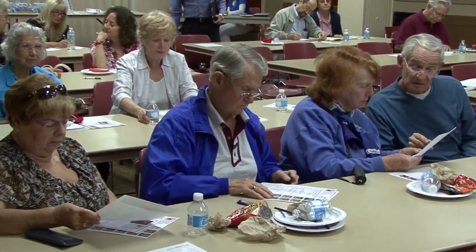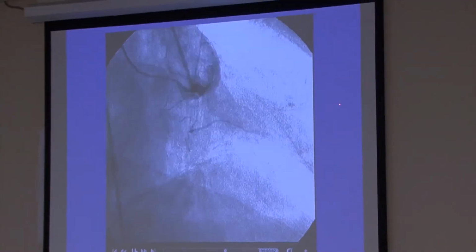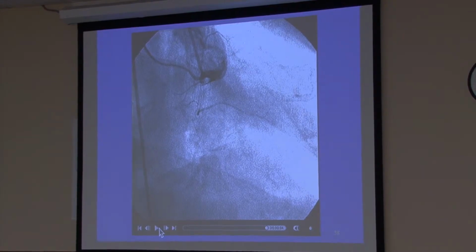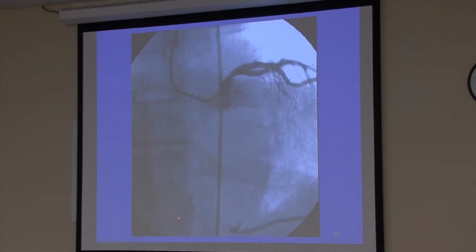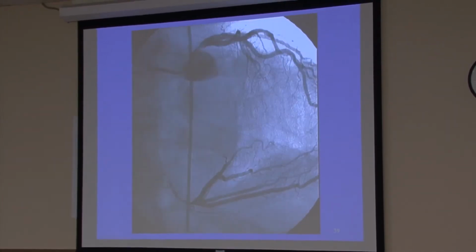And any muscle that's getting good blood flow is going to get the tracer. If we see a nice, uniform, even picture of the entire heart muscle, then we know there's good blood flow everywhere. And let me just finish that question. Say this fella with the completely blocked up right coronary artery, if he took a nuclear stress test, there would be a defect on the inferior wall of his heart. Even though these collaterals are here, we'd see a little defect in the muscle down there on the nuclear images. Do you see what I mean?